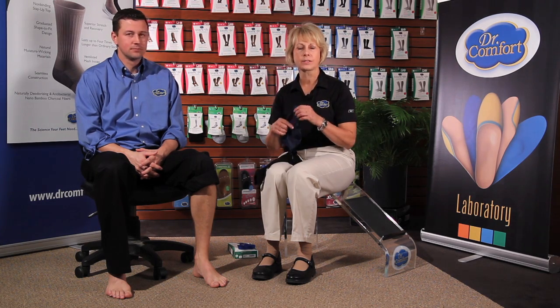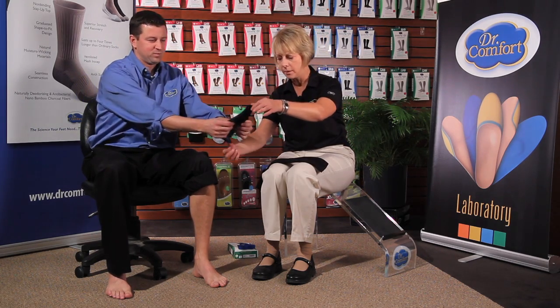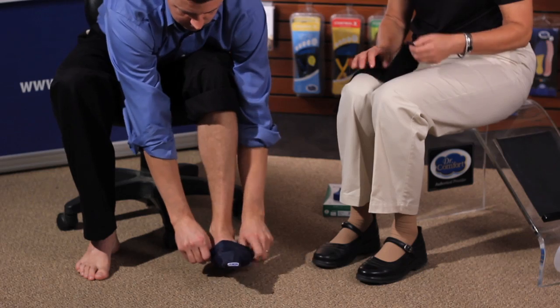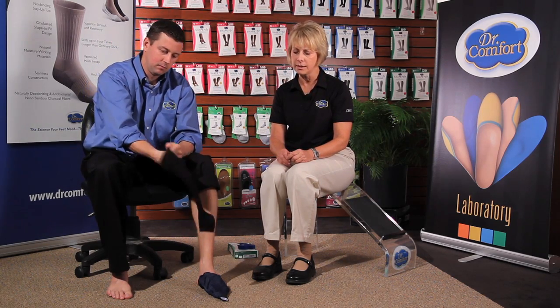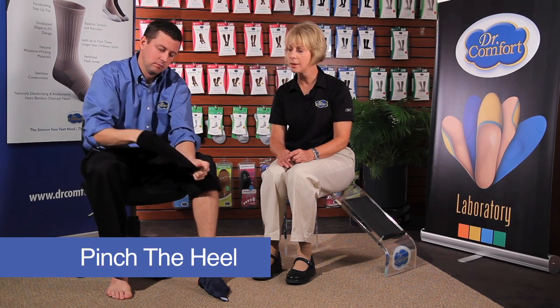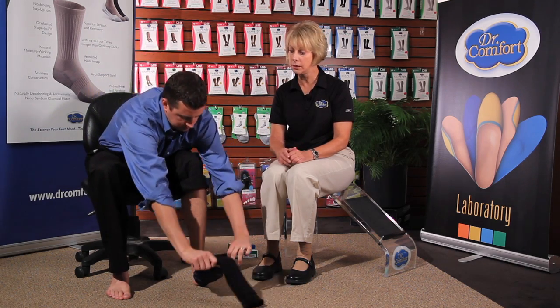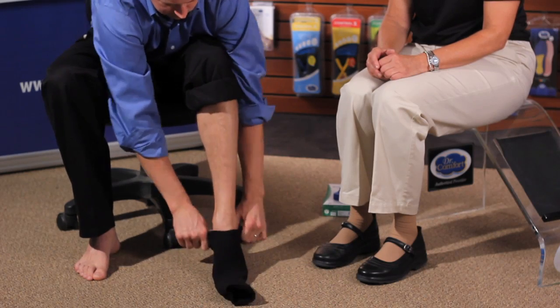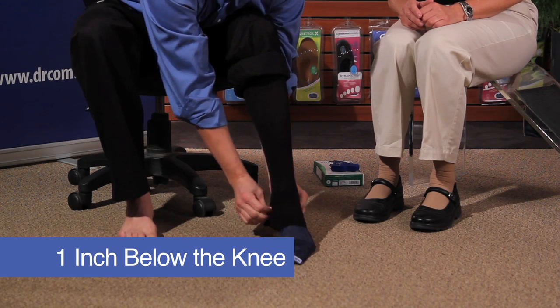Another donning technique is using our open-toe compression hose. In that box comes a toe slip, which makes it easy to don an open-toe stocking. Our model today is Brian, and he's going to show us how to do that. The toe slip goes over the toe, and then you use the same technique of putting your hand into the stocking and pinching the heel with your thumb and forefinger. Pull that inside out, make a little pocket. This time it's very easy to slide it over because there isn't anything to restrict you with the toes, and the toe slip glides over easily. Pull the stocking up to about one inch below the knee.